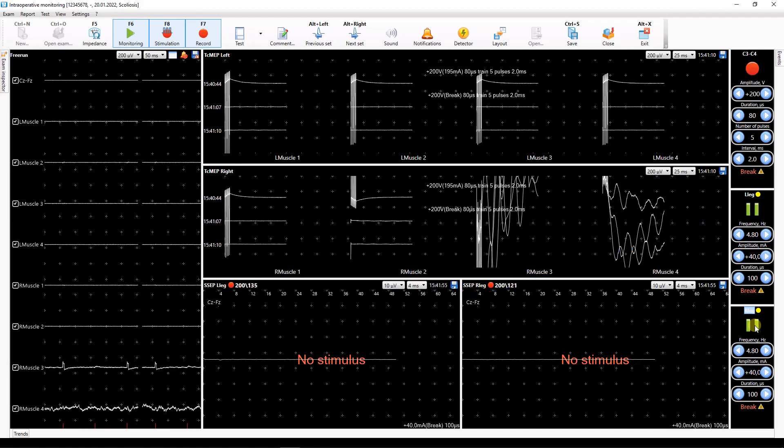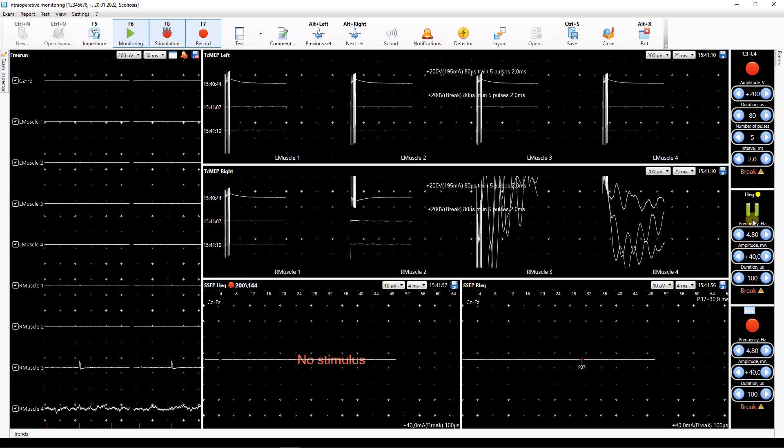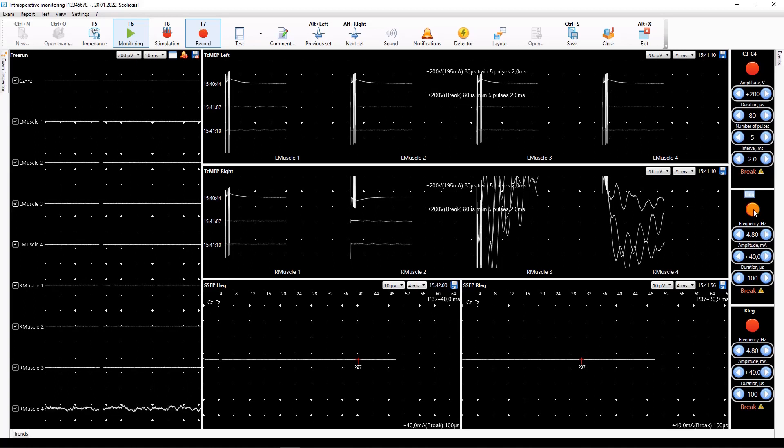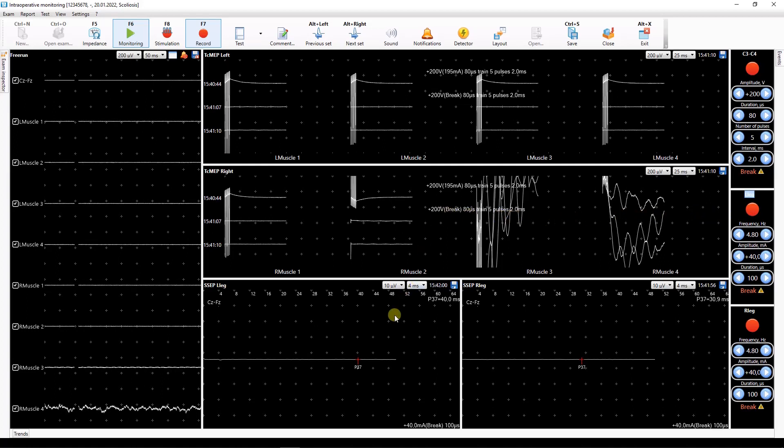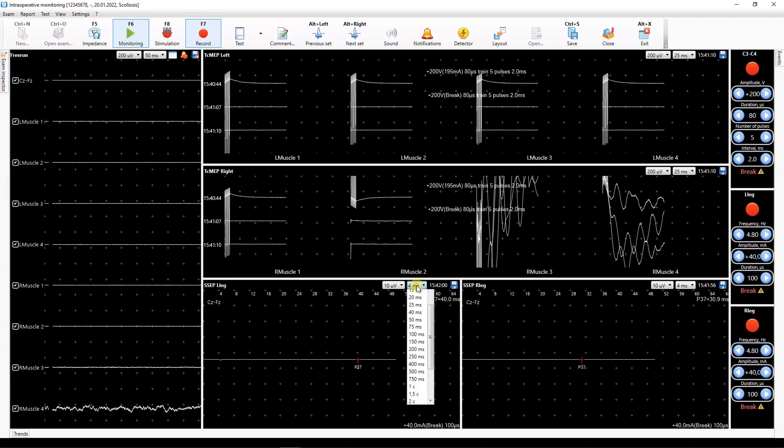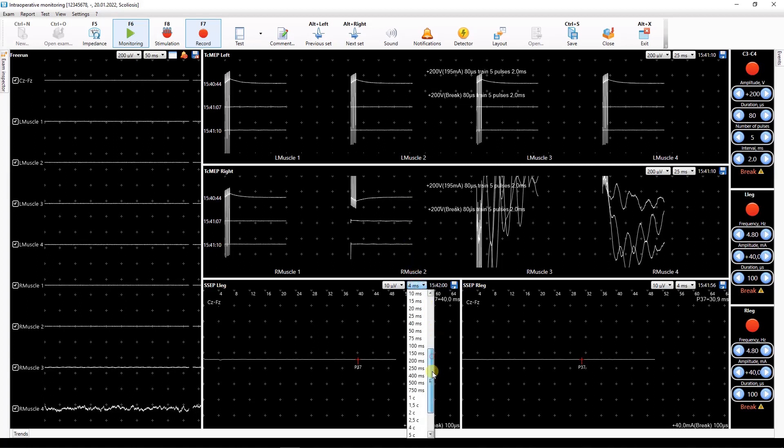To stop stimulation manually click the button on the stimulator window again. The trace scale can be changed by plus, minus, multiply and divide buttons or by simply selecting the desired scale in the drop-down list.